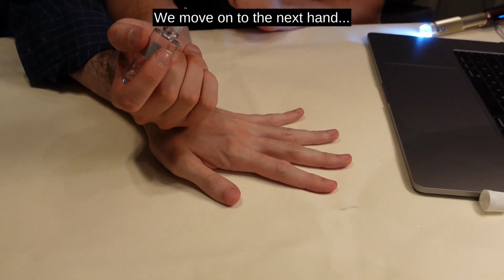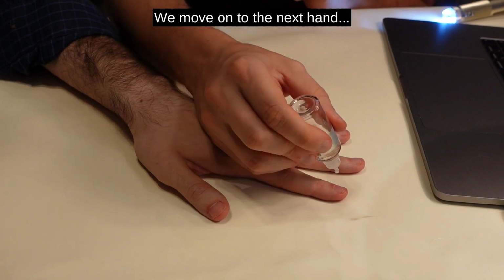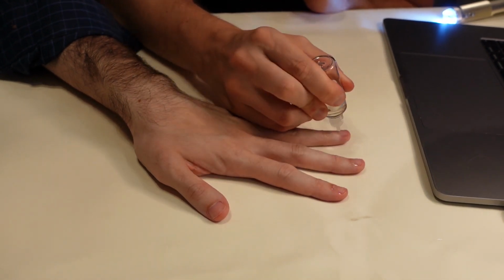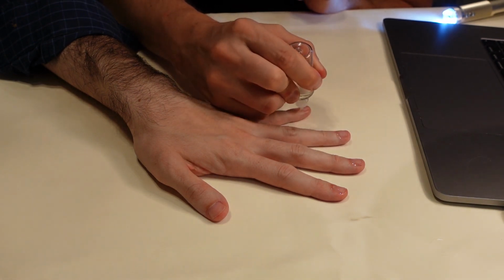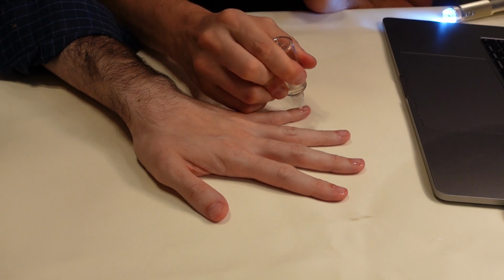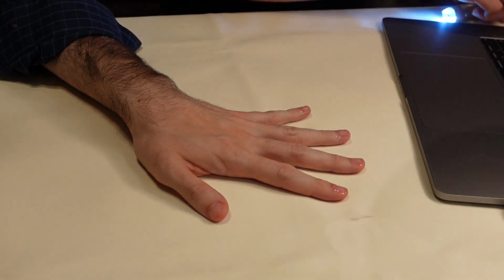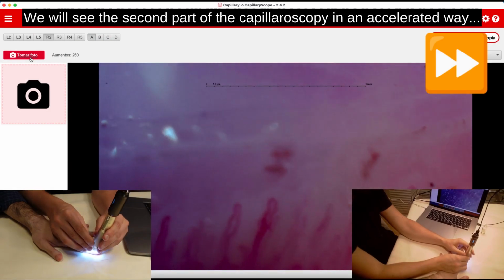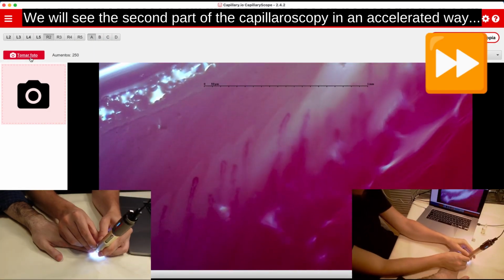Next, we will do the same process for the second hand. And of course, the first thing to apply is the immersion oil. I like this oil because it's somewhat dense and it will be on the finger for some time, so I don't have to reapply the oil that often and can take the pictures in a faster way.